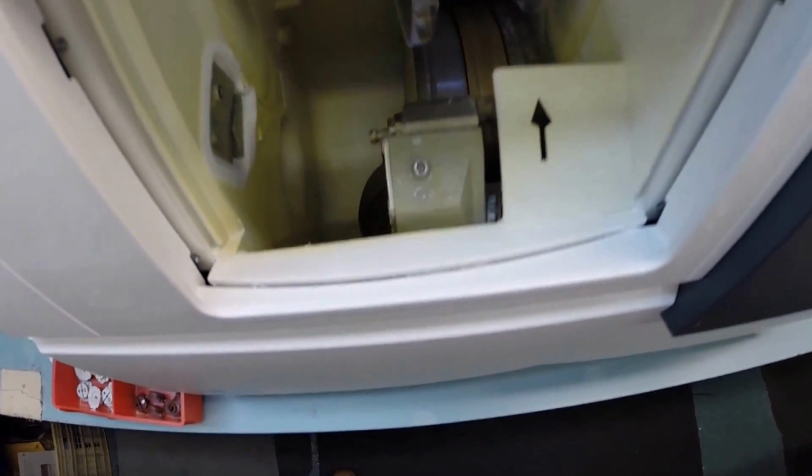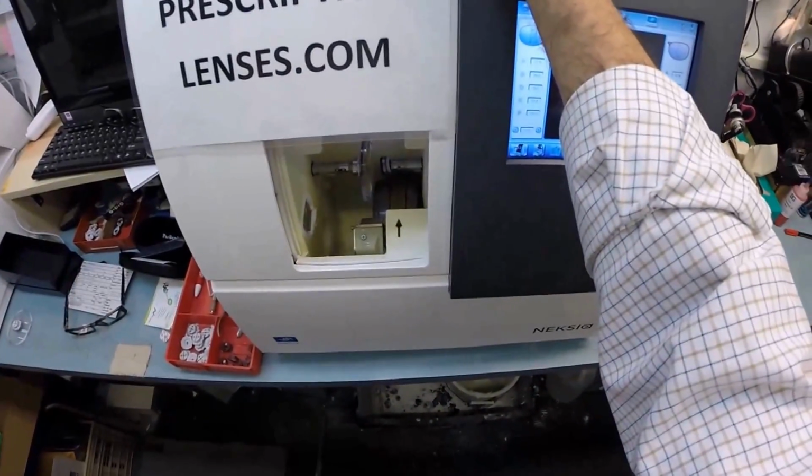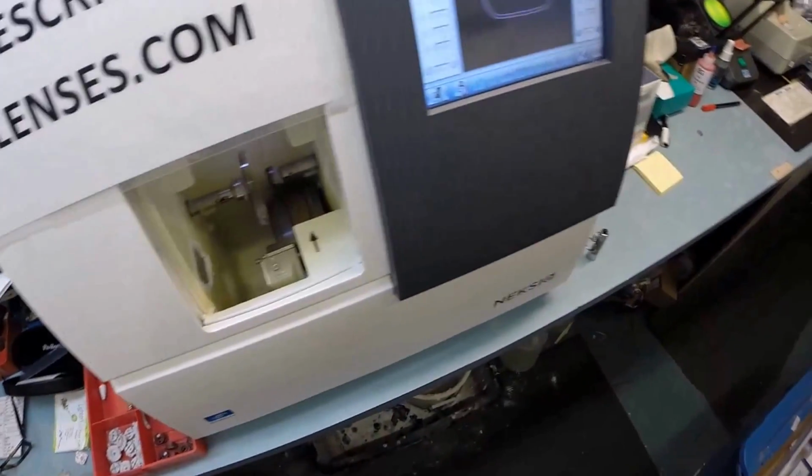So I'm going to take the right lens. Again, the magnet, the second fold, it puts it into the chuck, or as I like to say, the Charles, because I don't know the machine well enough to call it chuck. By the way, the machine costs $40,000. I recommend everyone go out and buy one. It weighs 200 pounds. Put it on your kitchen counter, and then you can cut your own glasses at home. You won't need me anymore once I demonstrate how all this works.